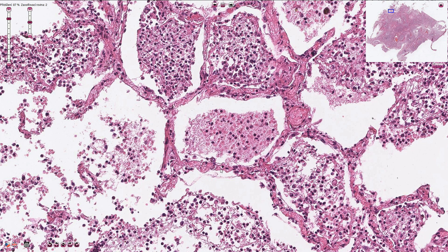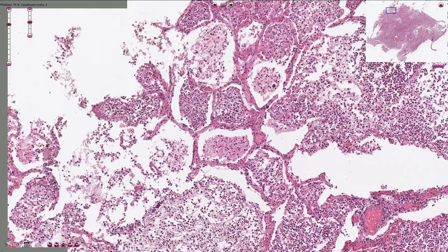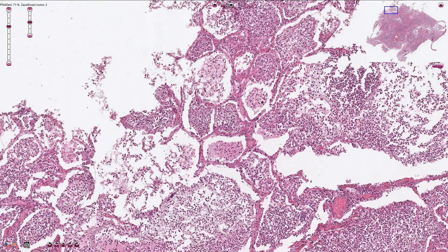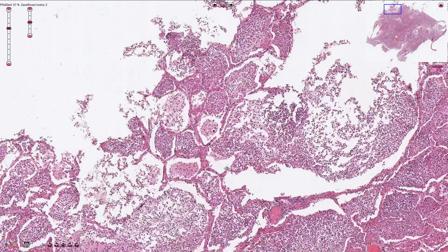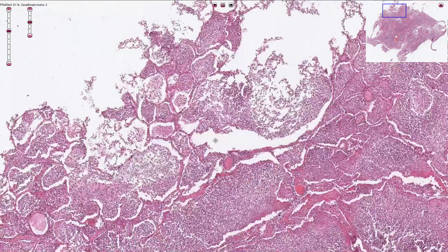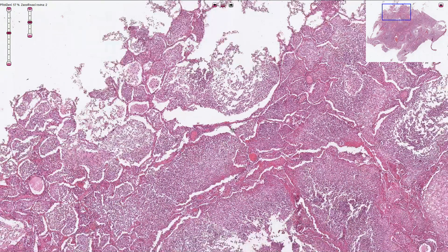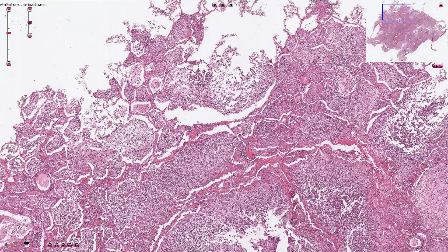When there is something else inside the alveoli, air cannot get there and we have a problem — this is the case of bronchopneumonia. Bronchopneumonia is basically patchy, multifocal inflammation of the lung tissue which starts in the bronchi and spreads to the adjacent alveoli. It is the result of bacterial infection, or sometimes fungal or other infections, but bacteria are usually the cause. The inflammation starts as catarrhal inflammation, with a lot of mucus in the alveoli.